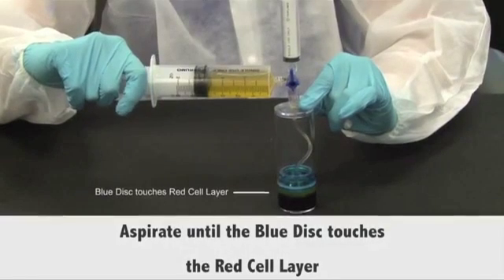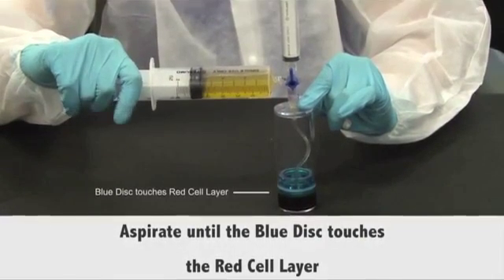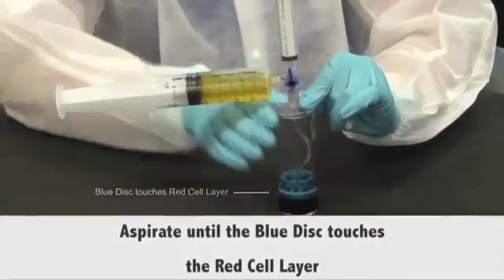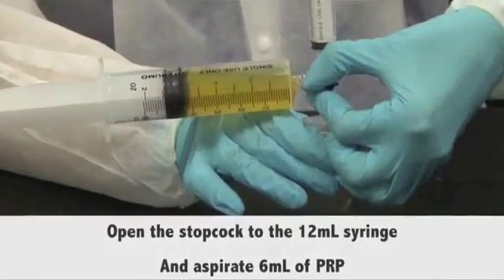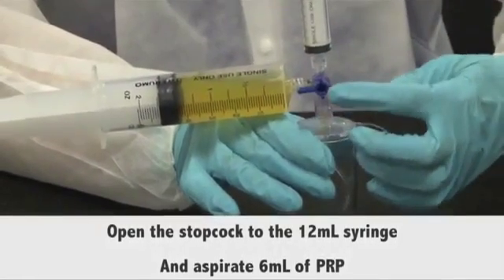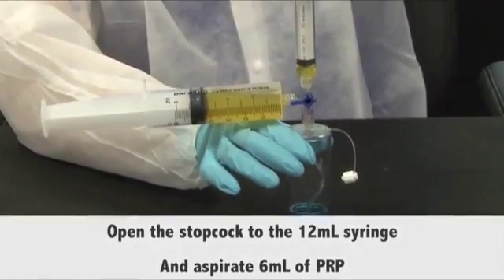Continue aspirating until the blue disc touches the red cell layer. At this point, open the stopcock to the 12 milliliters syringe, and aspirate 6 milliliters of platelet-rich plasma.